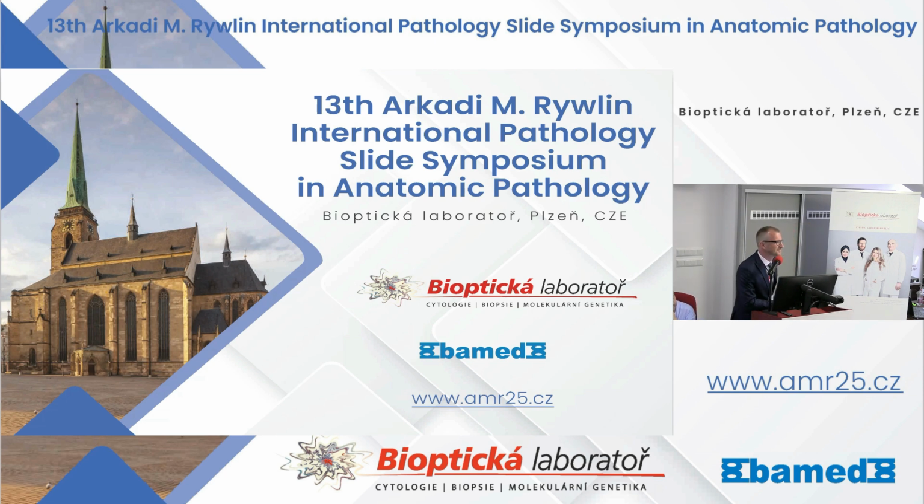Thank you. On your prostate biopsies, if the AI shows no coloring, do you even bother to pick up the slide and look at it under the microscope? Yes, I can't sign out a case which I didn't see. I'll be quicker, definitely quicker, but I can't sign out any even small focus I didn't see.